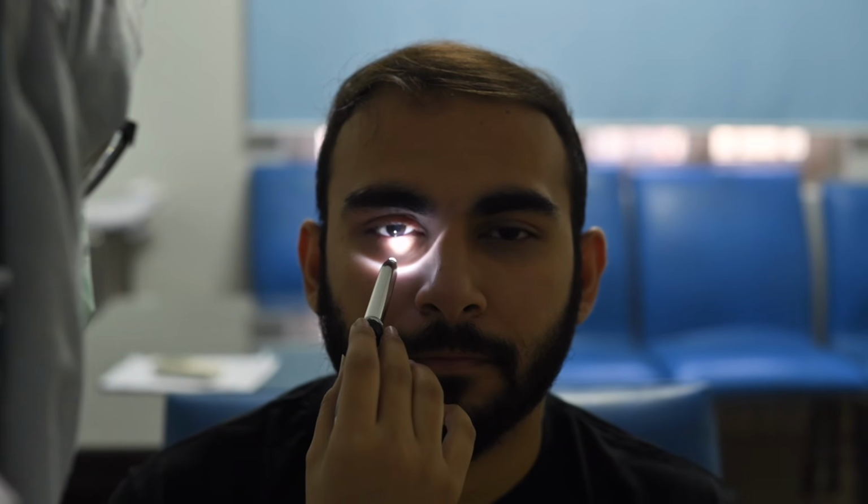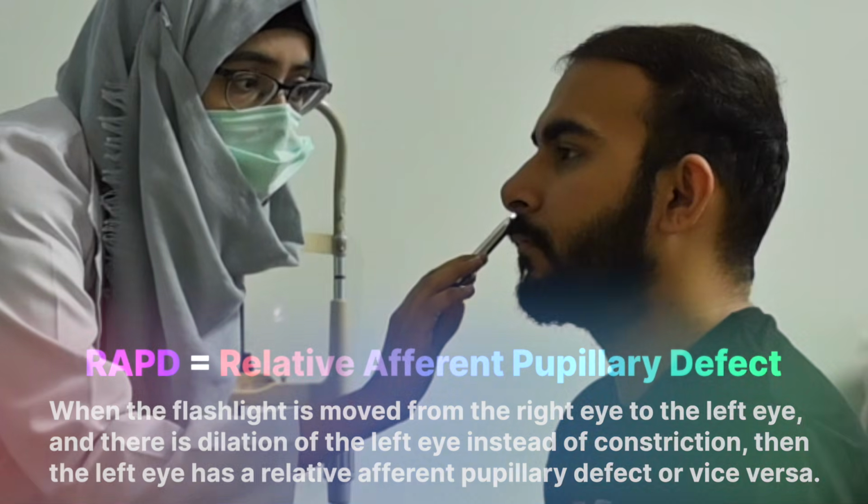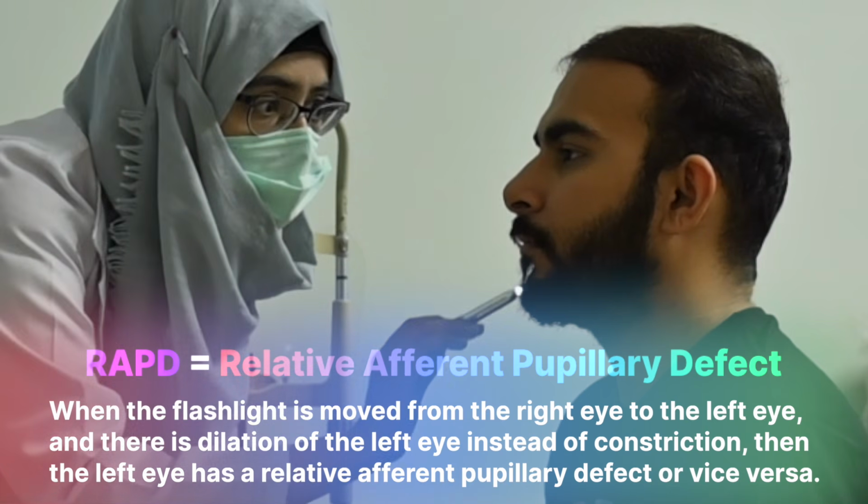As you can see, the pupil is constricting. If the RAPD is present, that is relative afferent pupillary defect, then instead of constriction, pupil will get dilated.